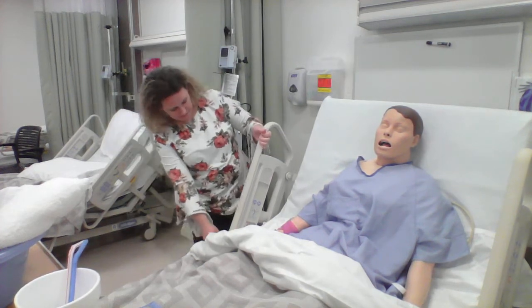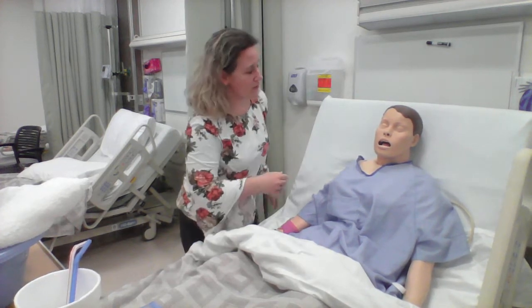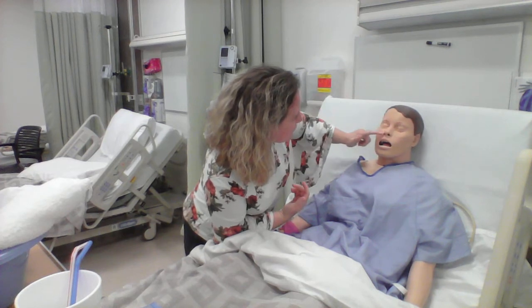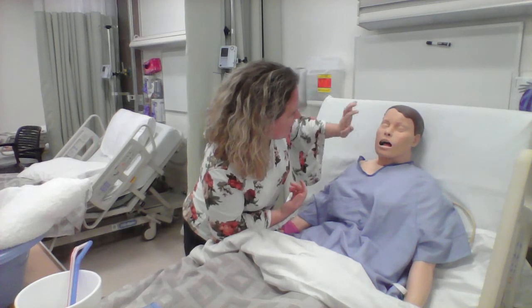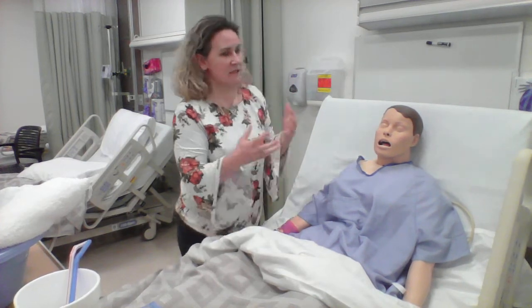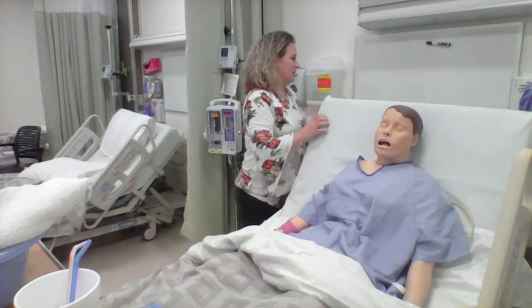I forgot how to put these things down. So we're going to go ahead and test the patency, and can you blow through this side and blow through this side? I think this side is a little bit more open. Are you okay if we use that side? Patient states that they are, so we're going to work on this side. So I'm going to grab some gloves.